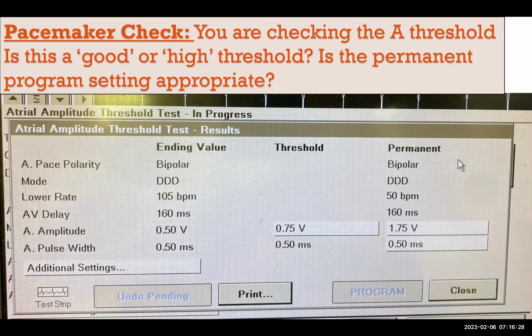And that's unfortunate. I think it reflects the fact that, particularly in the adult world, interventional cardiologists will often put pacemakers in patients, even though they may not be as well versed in electrophysiology. If you leave the device, the in-box outputs are usually 3.5 volts and 0.5 milliseconds. So basically, in a patient like this, you would be pacing at 4 or 5 times the output, and so you would use up the battery more, and the need for a generator change would be greater.